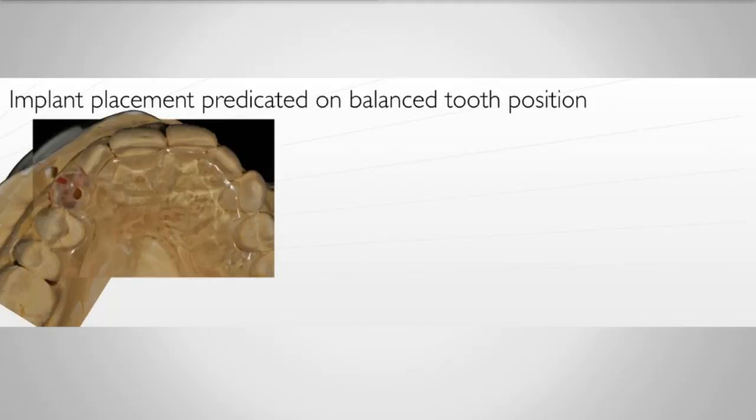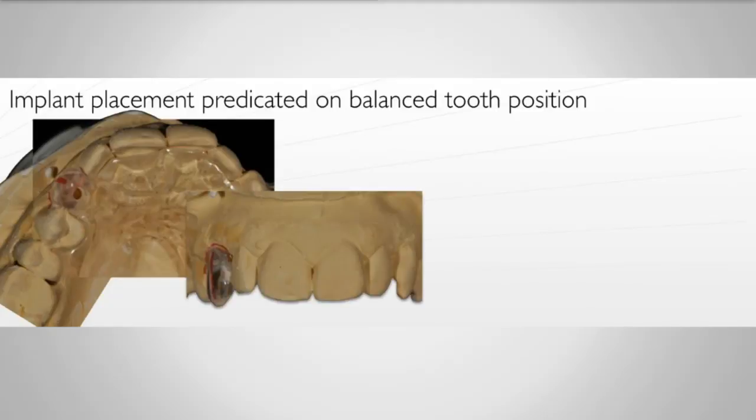So I had the laboratory wax my surgical guide. You can do this with virtual placement as well, but this is a handmade surgical guide. So here's the tooth out in a facial aspect. I also scribe a line on the facial aspect of the guide just to give my surgeons a little more guidance.